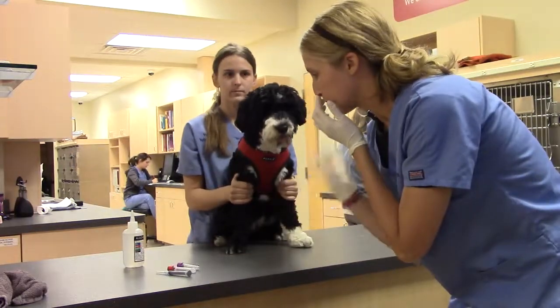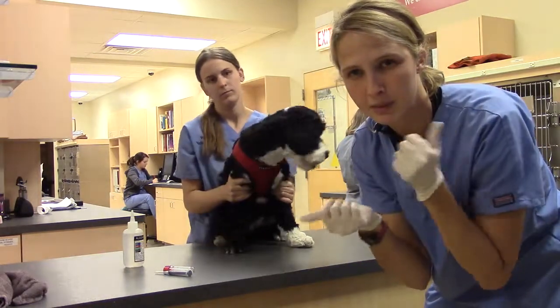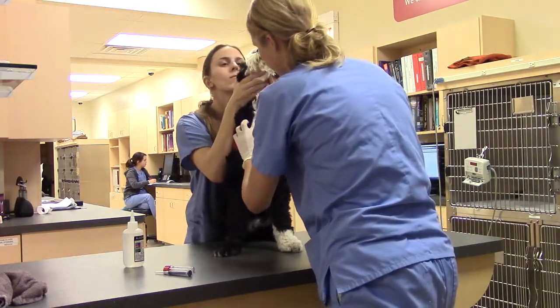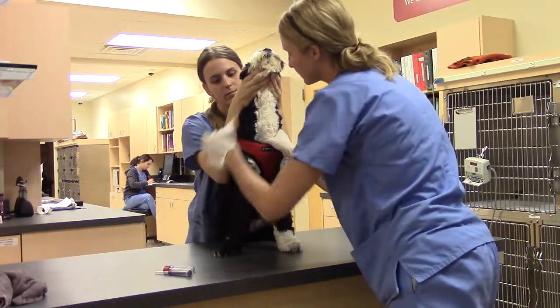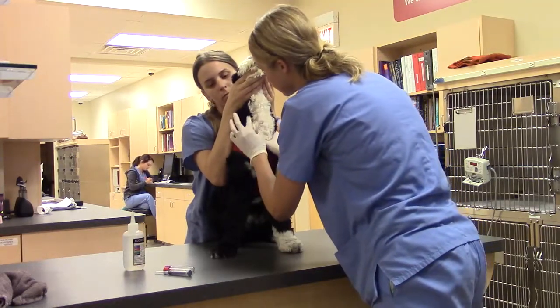First off, I'm going to make sure Sonia's got a good hold on her, and I'm going to push into the thoracic inlet so I can try to get that jugular to pop up to see if I can palpate it. Once it's palpating, I'm going to go ahead and put some alcohol on there. Make sure the hair is to the side so it makes it a little bit easier for visual.